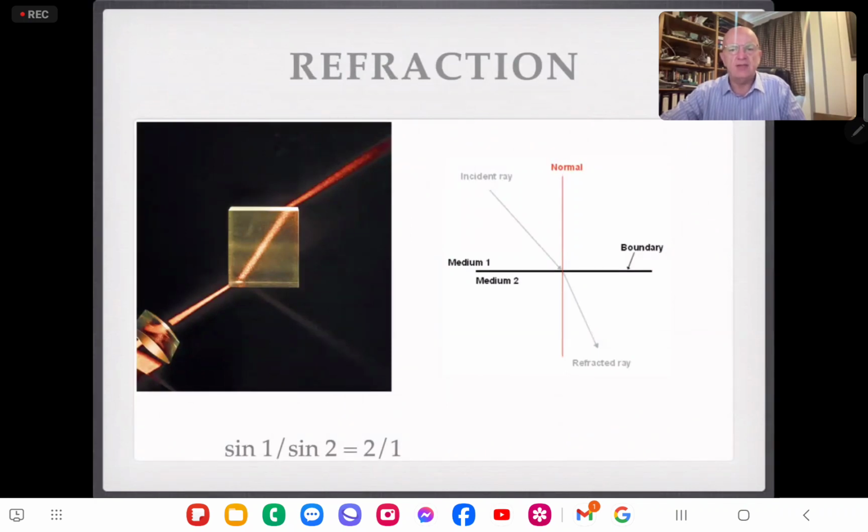Refraction means a change in direction because of a change in medium. So, let me give you an example. Imagine this 20 years ago, the kids were small and would go to the sea, and Sorka on one side, Fraser on the other side, would run down the beach at high speed straight into the water, and actually, it's much harder to walk through water, isn't it?